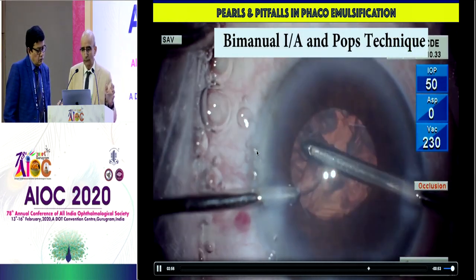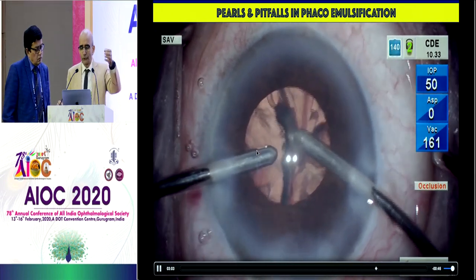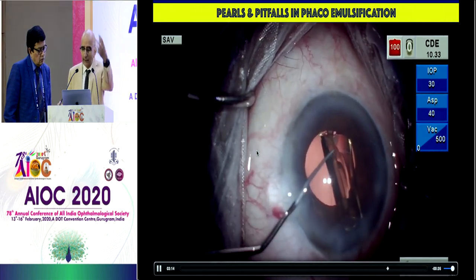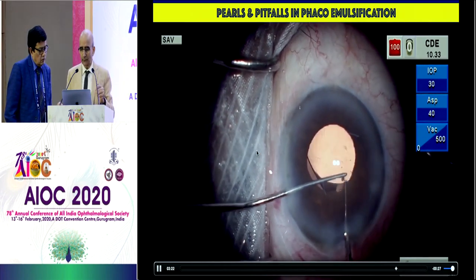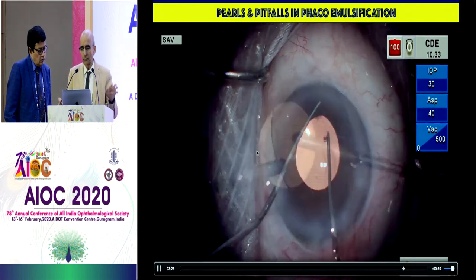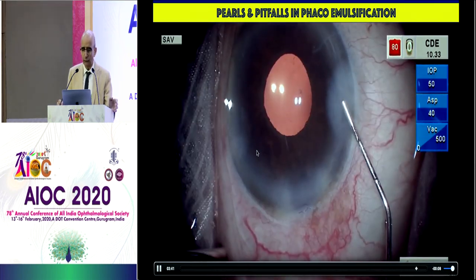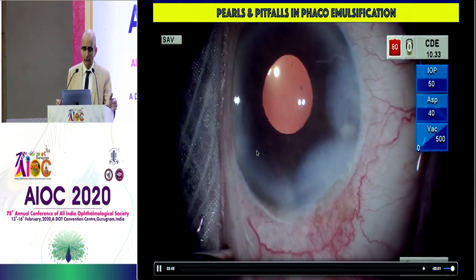Removing cortex bimanually, and also doing a step-by-step removal where you position the aspiration port underneath the anterior capsule, occlude it, then displace posteriorly so it's free of the anterior capsule, then swipe and aspirate. Implanting with a small pupil also needs a vertical displacement of the haptic-optic junction of the trailing haptic — you must try to do that. Go underneath and remove the viscoelastic from behind; being cohesive, it will come out very soon with 40 cc flow rate.